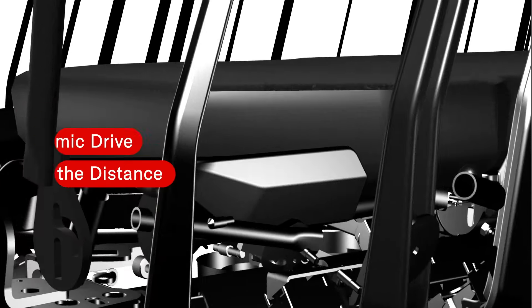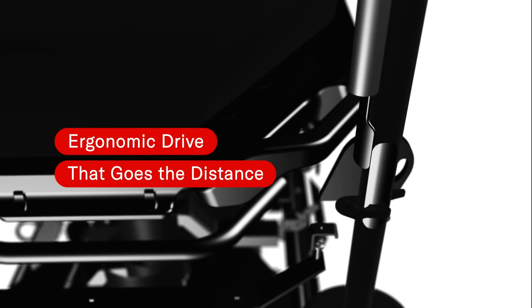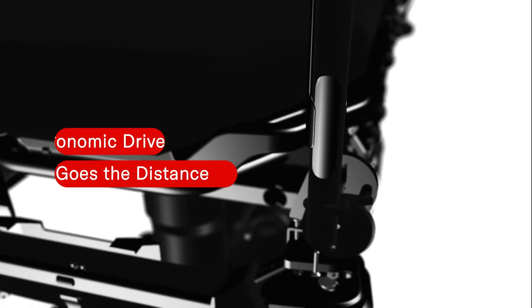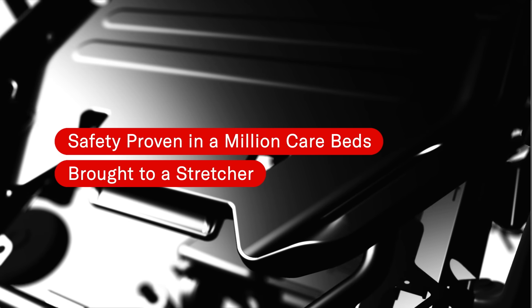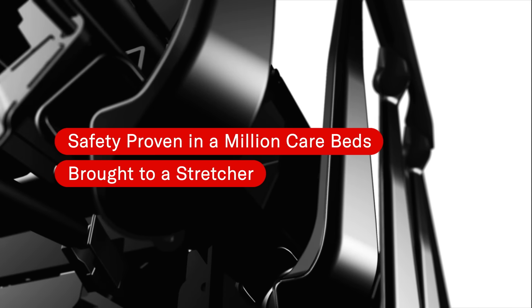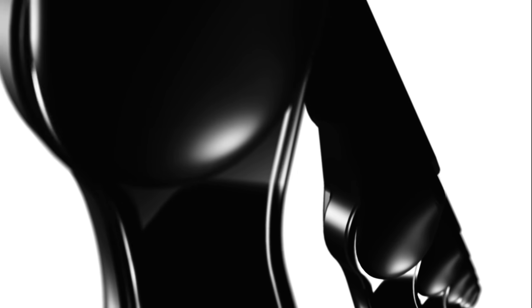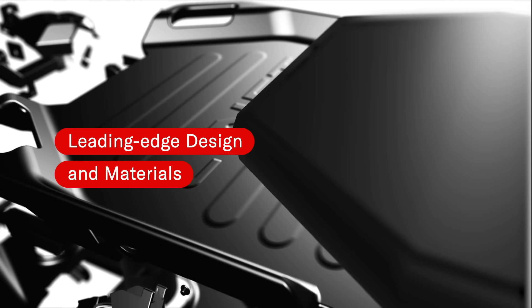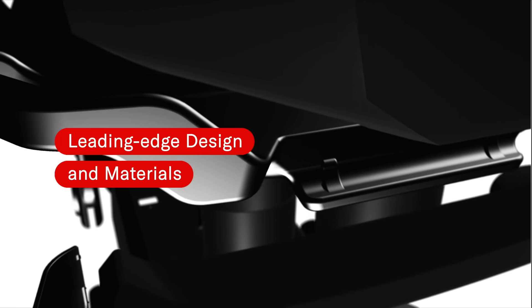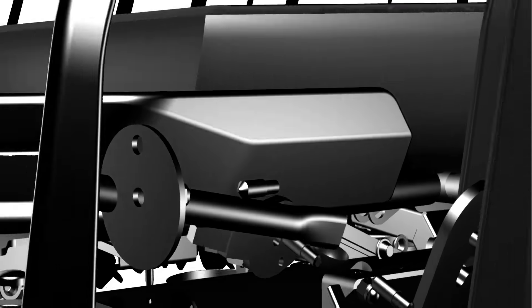Imagine a stretcher that redefines ergonomic patient transport, requires only a touch of a button to drive, and offers superior driving distance. Imagine a stretcher that redefines safety, leveraging 30 years of expertise in care beds, bringing the key features to a stretcher. Imagine a stretcher that redefines design and pushes durability to new heights thanks to leading-edge materials.